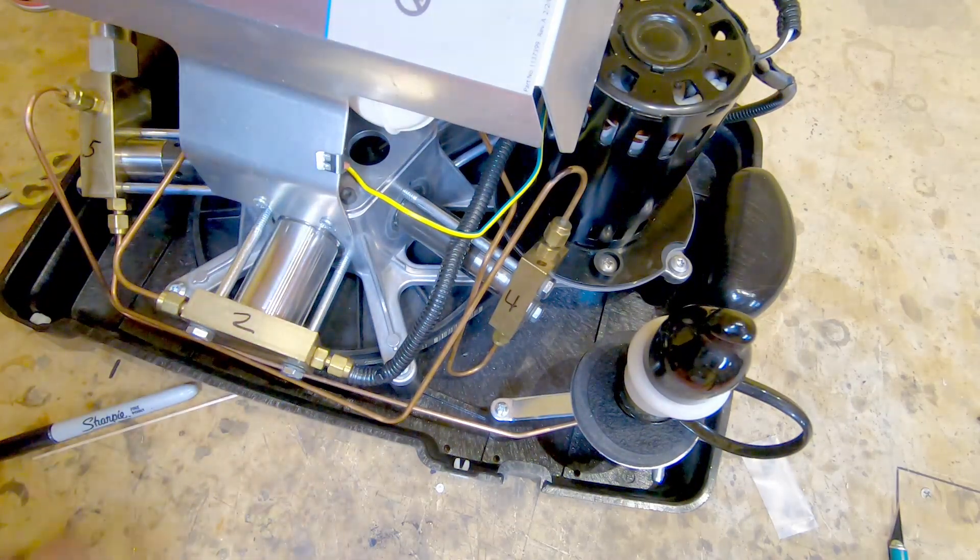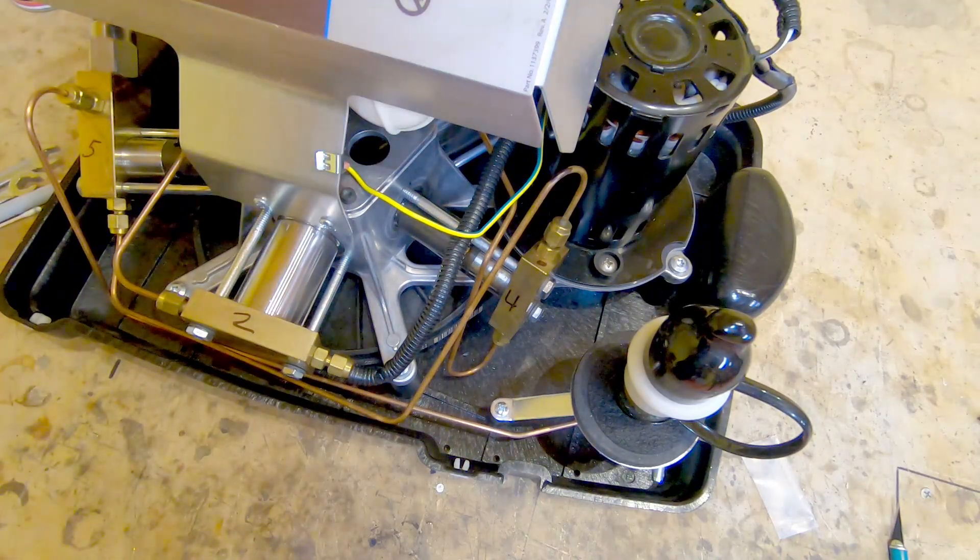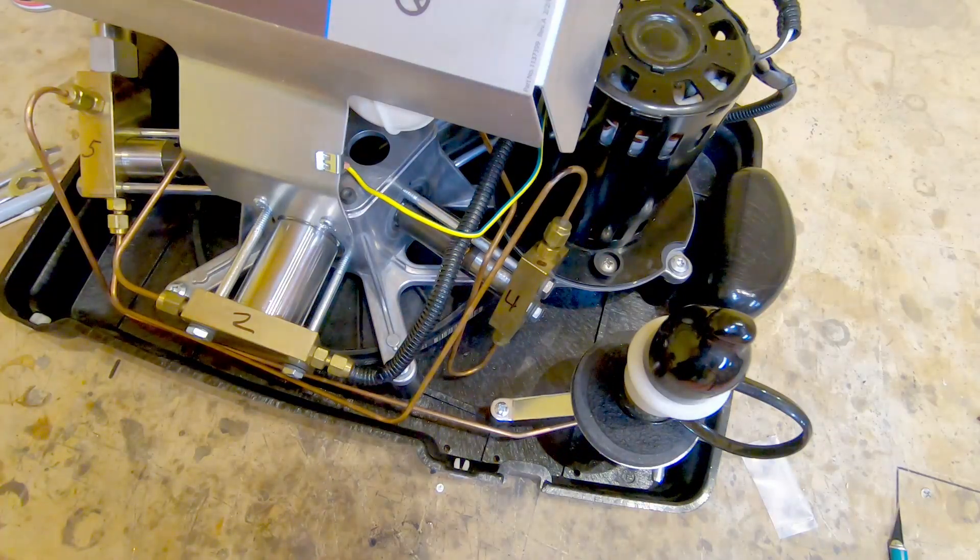So there we have it — home fill seal replacement, as attempted by a guy who doesn't know how to do it but kind of has some skills and some experience. Hope it helps, hope somebody finds it useful. Bye bye.